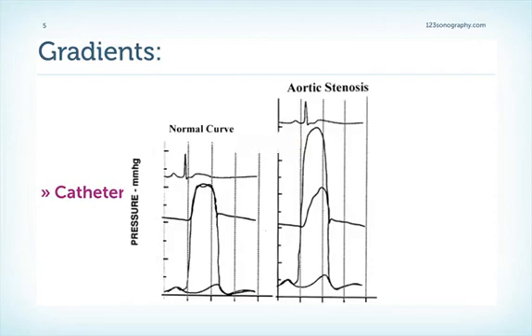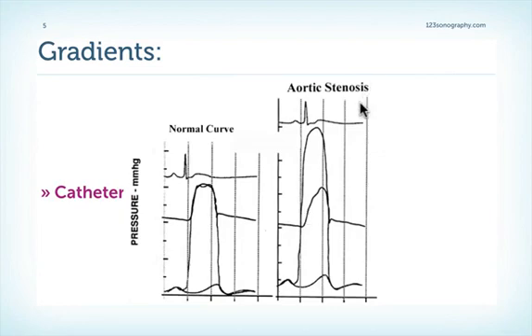In the cath lab, we can directly measure the pressures in the left ventricle and in the aorta, either simultaneously or by pullback method of the catheter. These are the simultaneous tracings of the left ventricle — look at the high pressure — and in the aorta. The peak-to-peak gradient, which is frequently measured in the cath lab, is not a physiological or real measurement. It does not represent the actual pressure of the left ventricle and aorta at the same time, and it is usually lower than the maximum or peak instantaneous gradient measured by Doppler echo.